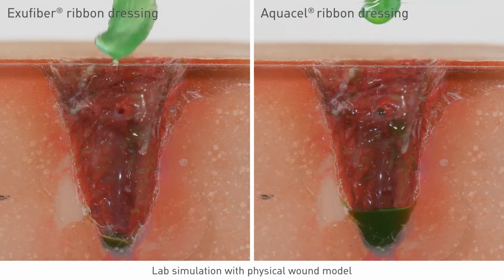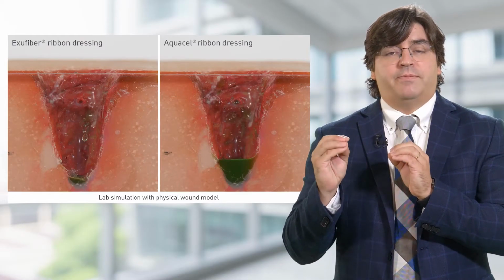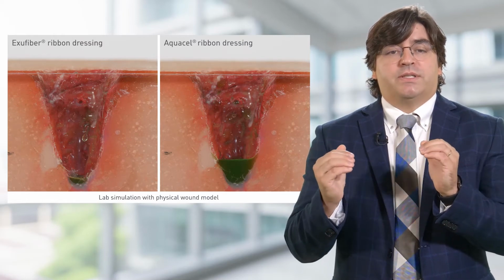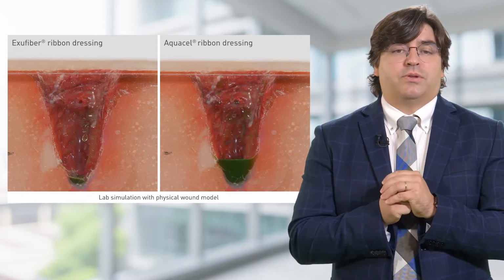And you can see here in the hand, it's amazing the difference with the same amount of exudation. There's a huge difference on the amount of exudation from the left, from the right side. You see on the right side, the plug effect that I talked previously, because it's not able to absorb the amount of exudation that we want on that wound.